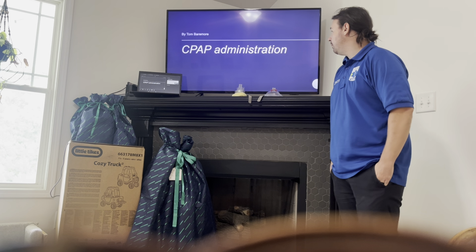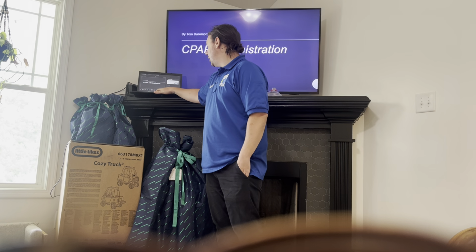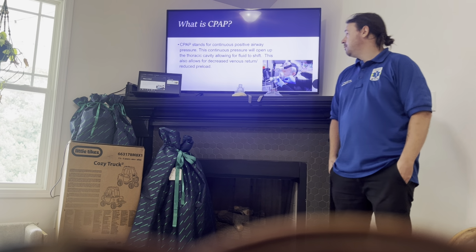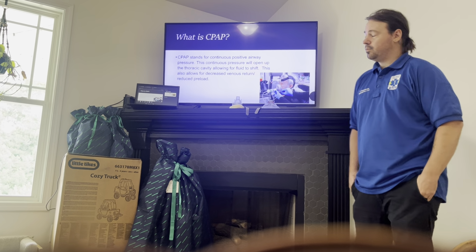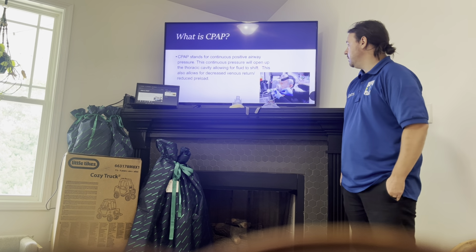I'm here to talk about the administration of CPAP. CPAP is a treatment modality we use for patients that are in respiratory distress. What is CPAP? CPAP stands for continuous positive airway pressure. This continuous pressure will open up the thoracic cavity, allowing for fluid to shift in episodes of pulmonary edema.